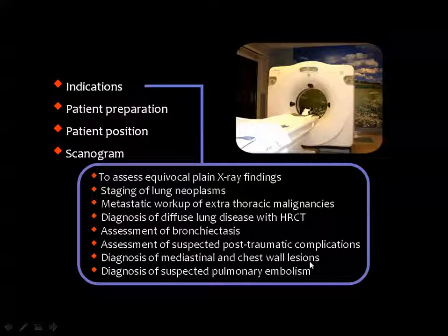And this is a very important indication, to assess a suspected pulmonary embolism, because of the very fast scanning nowadays and the easy evaluation of the vessels all over the body through intravenous injection of contrast media made the CT scan one of the important tools for vascular imaging nowadays.